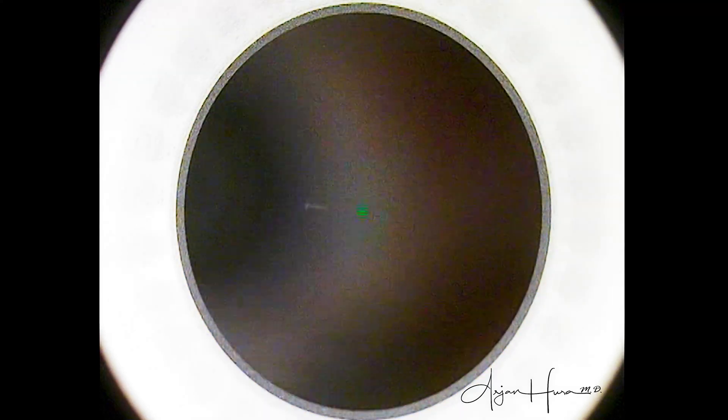Now, just as with LASIK, the surgeon can choose to proceed in a variety of different sequences. For example, a surgeon can create the LASIK flap, lift the flap, do the treatment ablation, lay the flap back down, and then move on to the second eye. However, most refractive surgeons will prefer to create the flap in each eye first, and then do the treatment.